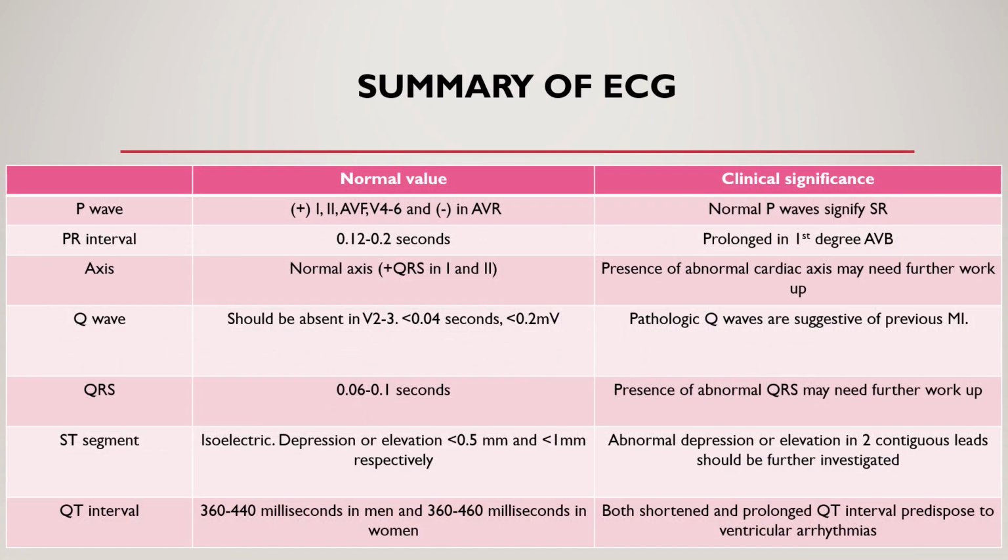So let's talk about the summary for the first lecture. On this table you see different EKG parameters, normal values, and clinical significance. Let's take a look and review this table.